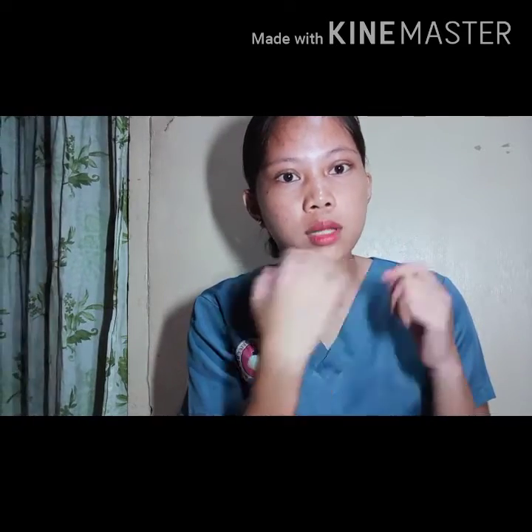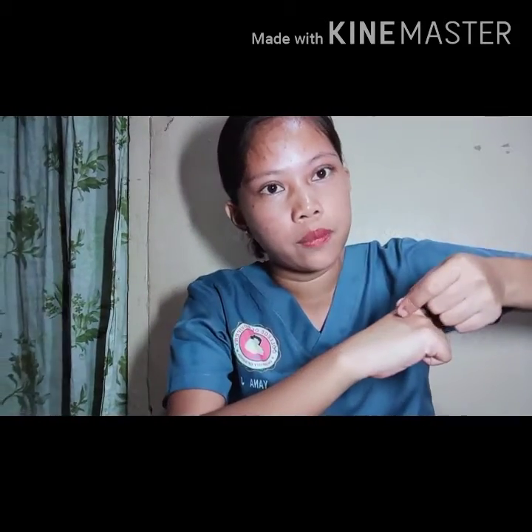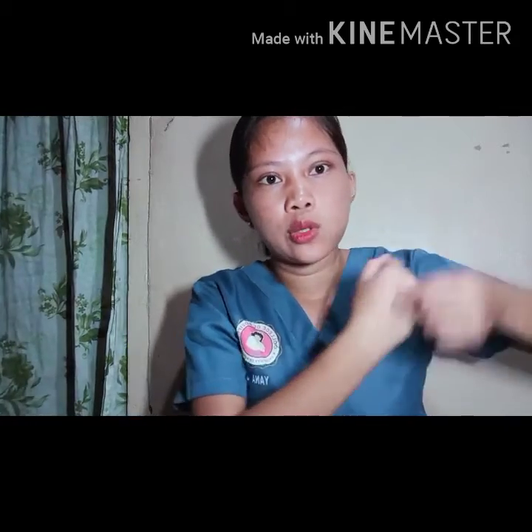Kay kinta iyang dominant hand is sa left, so di ka mo insert og catheter ana kay matandog na siya. Kanunay kung anak ka mo butang kay syempre mo man ikapunan niya gamiton, so ari jud ka sa right. So hold the over the needle catheter. So mag-insert na ka og needle, dapat way pagbaduha, trust your fingers nga mauna jud nga ugat, hit na jud.